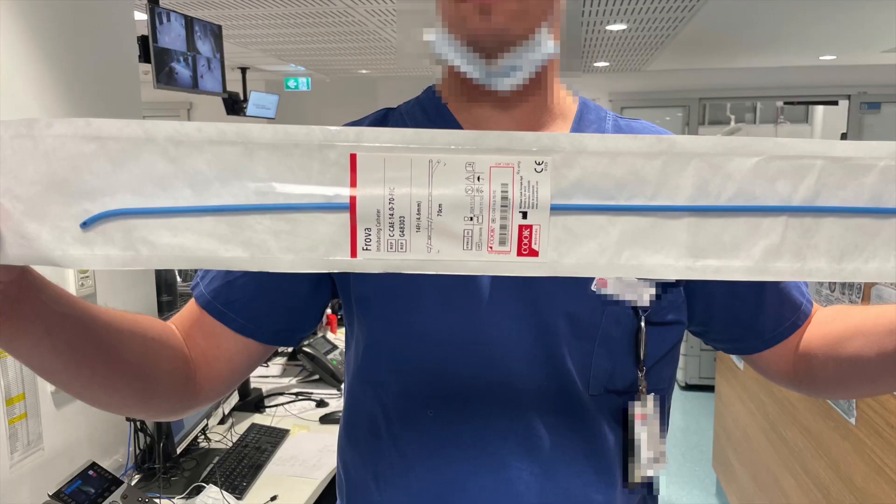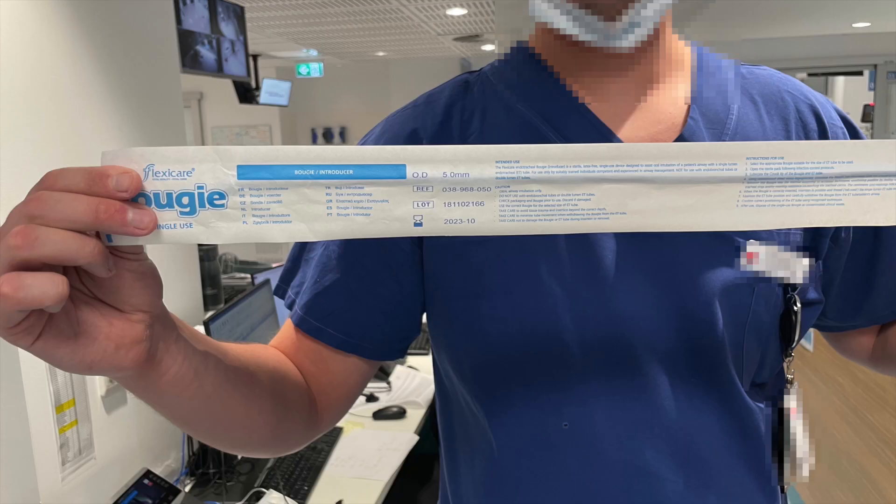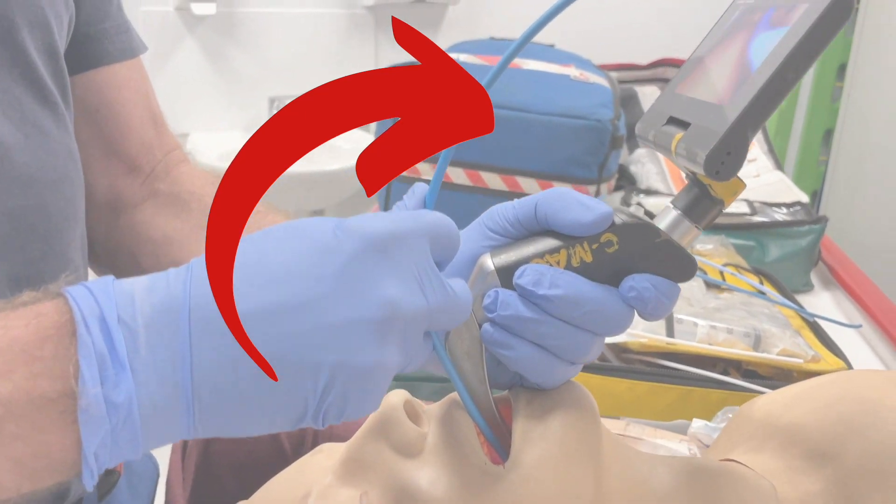Note that we used the throw-over bougie in this video. It's important to remember that there are other bougies on the market that handle very differently, and you can click here to see my comparison with some other similar looking bougies.